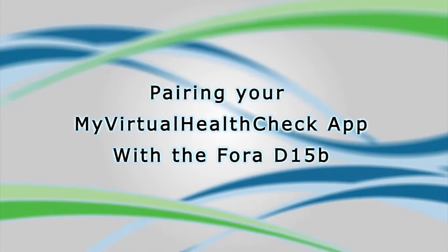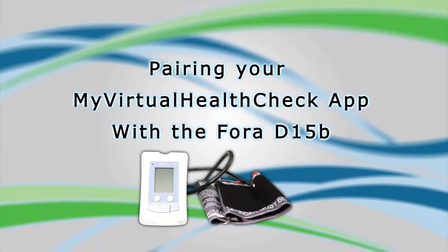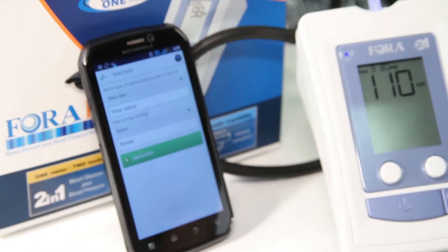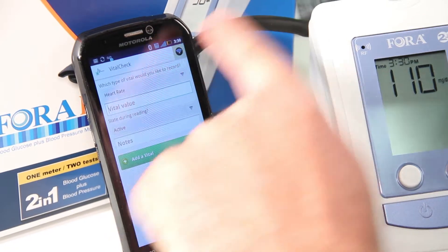Pairing your My Virtual Health Check app with the 4D15B. Begin by tapping the plus sign at the top right of the screen. Once on the add vital screen, tap on the wireless icon at the top right.